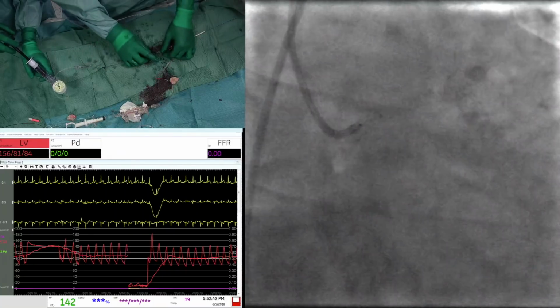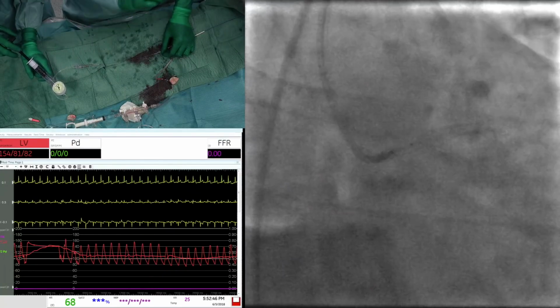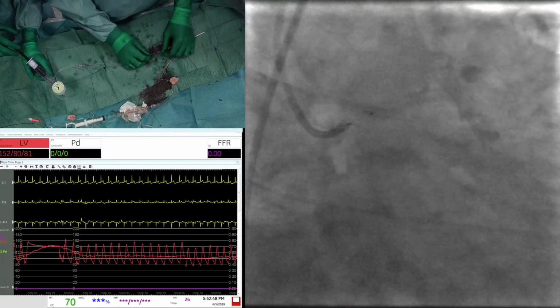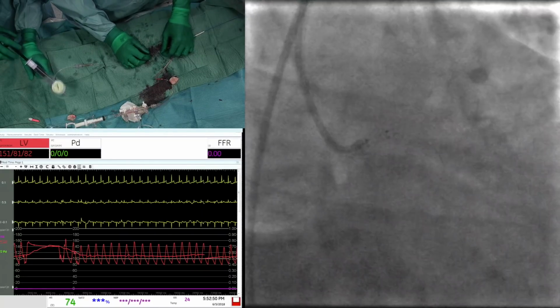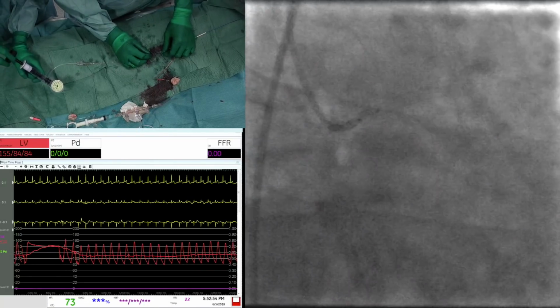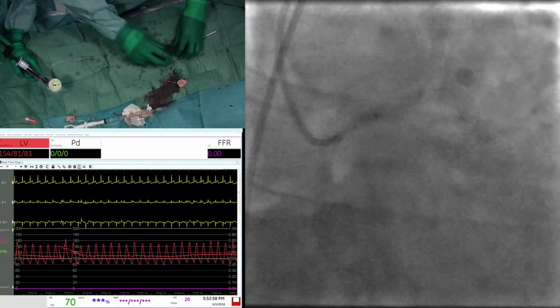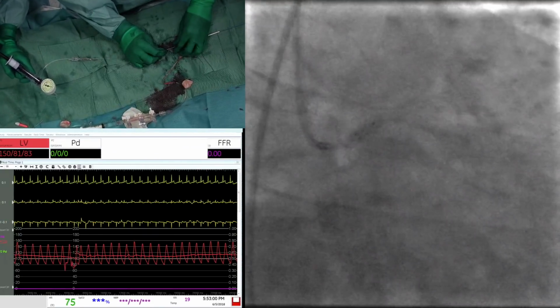And now your goal is nothing else than to upsize the proximal main branch size. So what I remember is that we have to put the marker just in the middle of the lumen of the side branch. You agree with that or not? Absolutely. Okay, go.